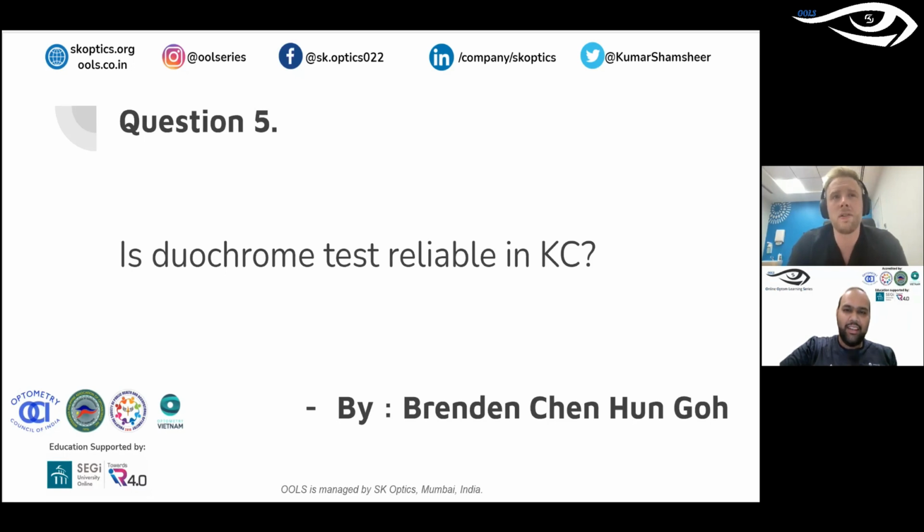And how useful is the information? These patients have a lot of higher order aberrations that's going to throw this test out massively. The duochrome is generally a specific test. We're deciphering between red and green, which is 0.50 diopters apart. Some of these patients, you'll take out, you'll put in a 4 diopter cell and they'll read 2 letters more.